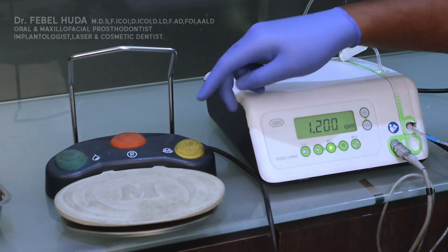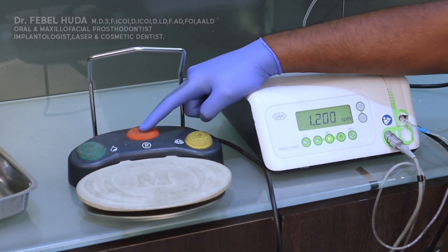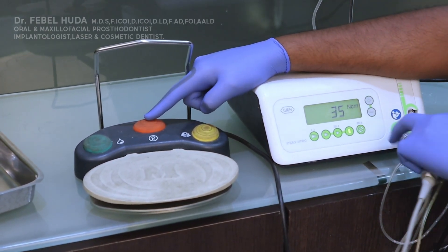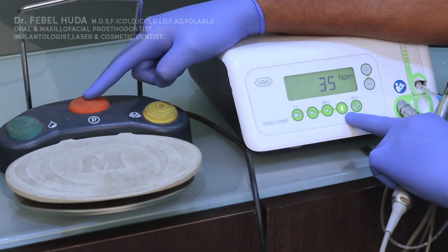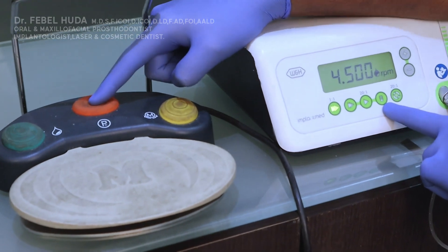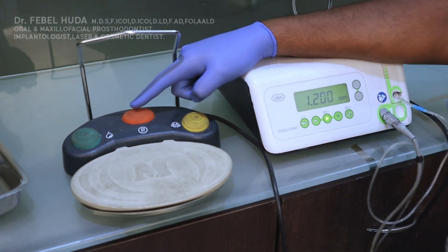The orange button controls your program. When you press it, it switches from the drilling program to the implant drive program. You can keep toggling through programs — since we're focusing on implants, we'll stick to these two programs.